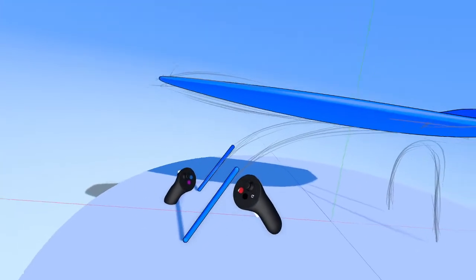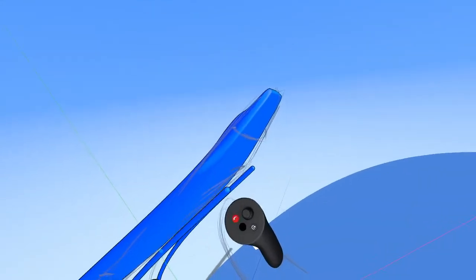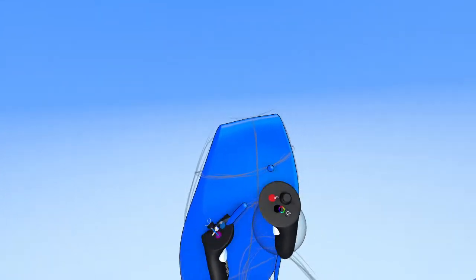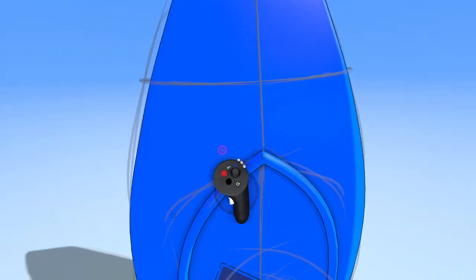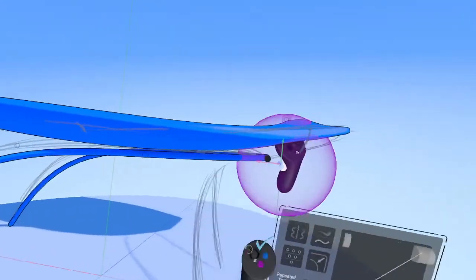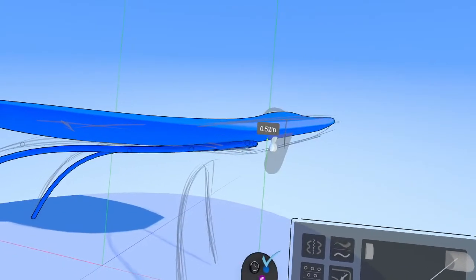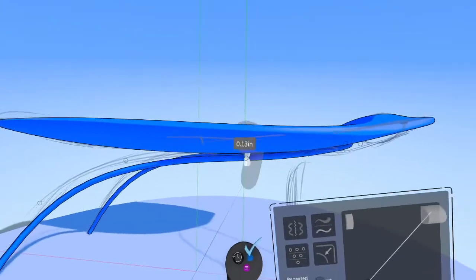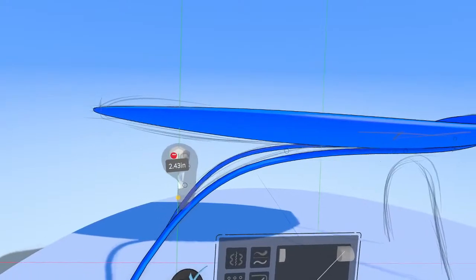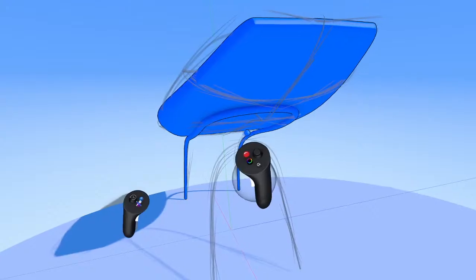And what point mode allows me to do is, instead of sketching freely like we did with the ink tool, I can just drop an edit point every single time I press the pointer finger trigger, and when I want to close it off, press the pointer finger trigger on the opposite hand. All right, so that looks decent for one leg. Let's do the next one here.